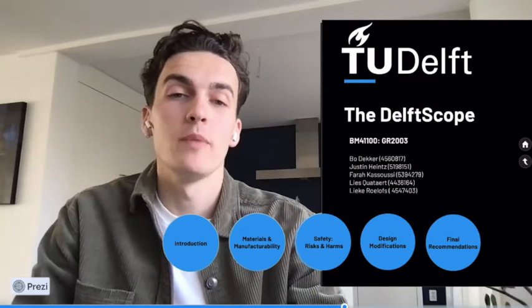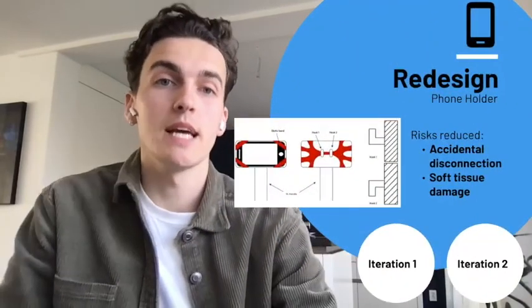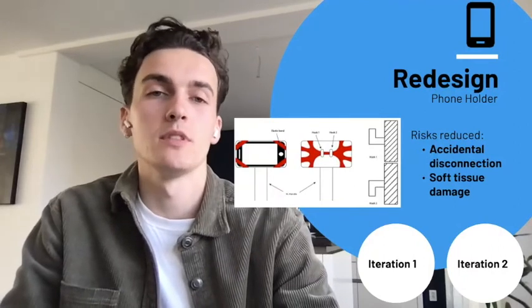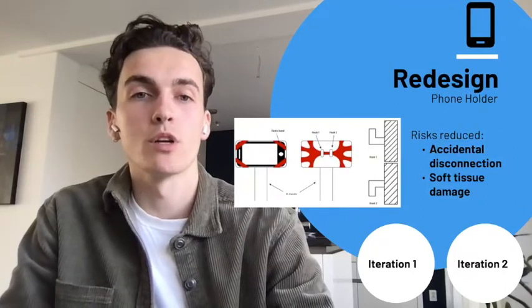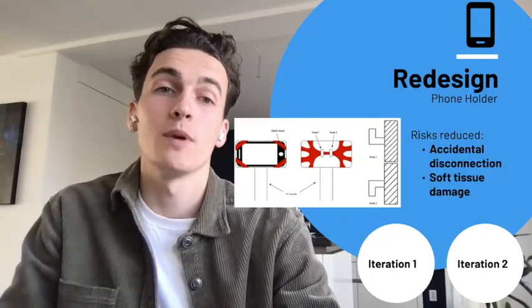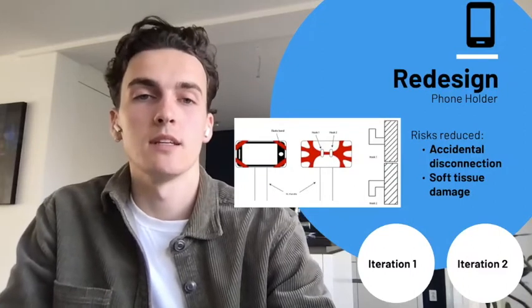As stated by Lies, we have made some design modifications in comparison to the original design of the Delft scope. The proposed redesign is focused on minimizing the risk of accidental disconnection of the wire connecting the USB endoscope and the smartphone. The current design proposes a long cable to make it possible for others to hold the smartphone. However, this may lead to entanglement of the cable with other objects in the operation room, which subsequently can lead to pulling on the cable and to disconnecting of it.